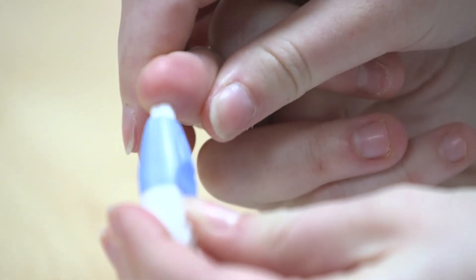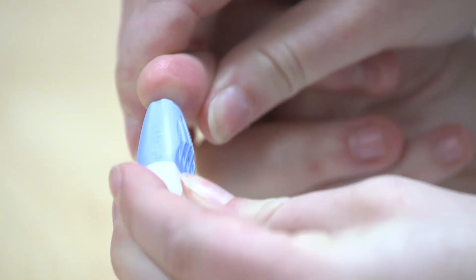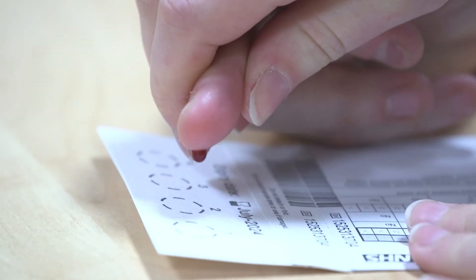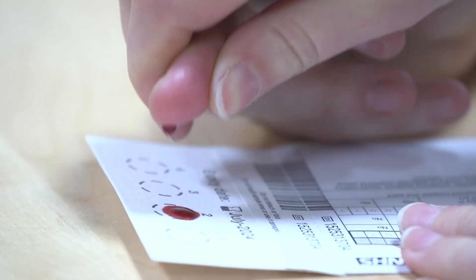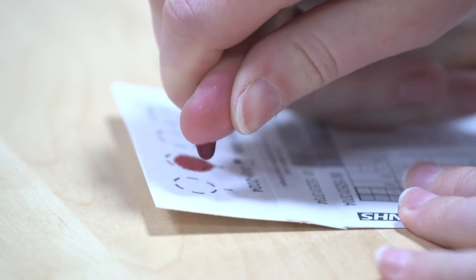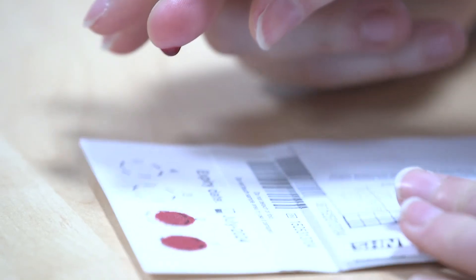Blood may appear straight away; however, if not, gently massage but don't squeeze the finger. Massage the finger until blood appears. This is how you obtain a good spot. Do not press the finger onto the card.